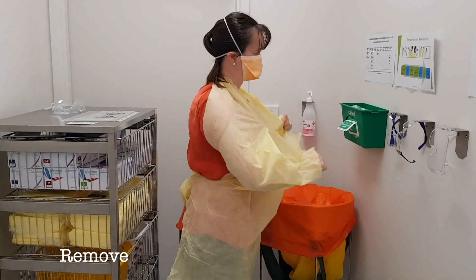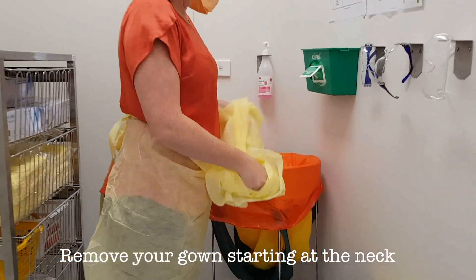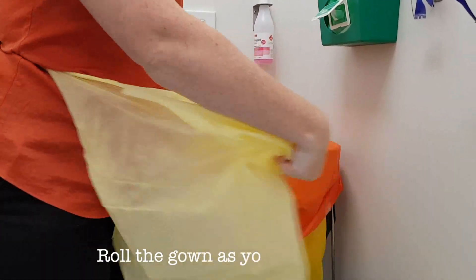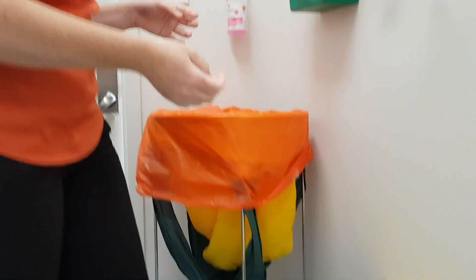Remove your gown from around the neck first. You can either untie or tear. Roll it down as you progress down your body, and then as you roll it up, put it into the bin.